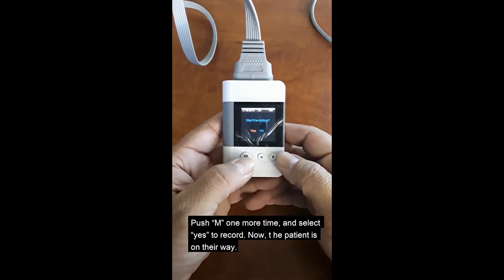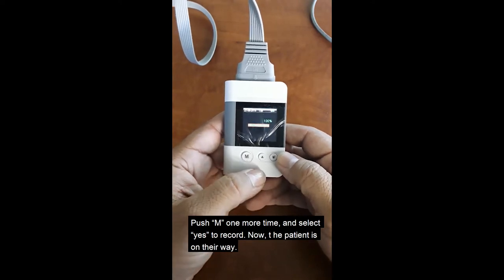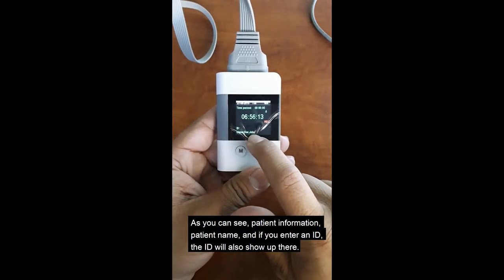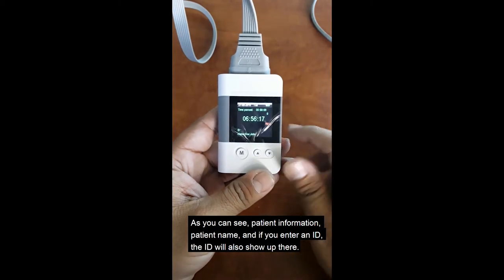Push the M one more time. Record yes. That's the formatting, and the patient is on his way. As you can see, patient information and patient name show right there. And if you enter an ID, the ID will also show up there.